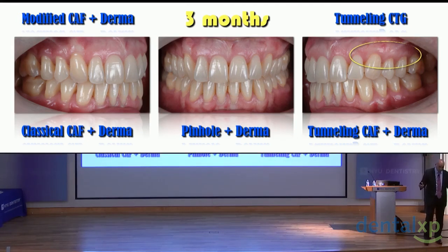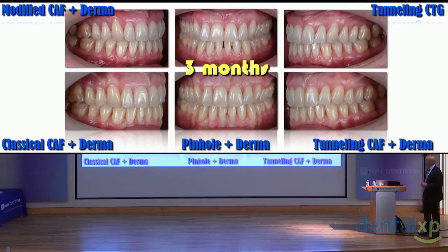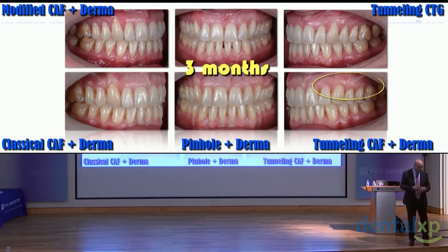I have many cases like this, many cases. And the tunneling technique works better in my hands than the cuff, maybe in my hands. Three months later, look at the tissues before and after. Maybe I don't know how to perform the cuff, I don't know how to release flaps, but I get 10 millimeters of vertical GBR procedures with the same problem. So I don't know why. It doesn't work in my hands.